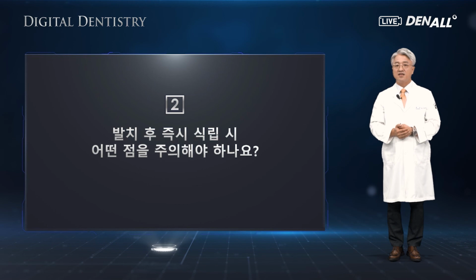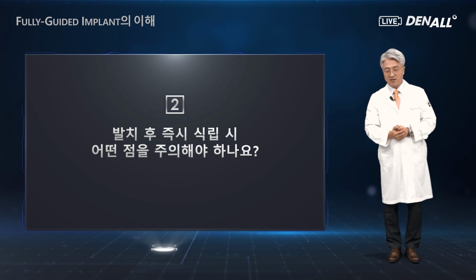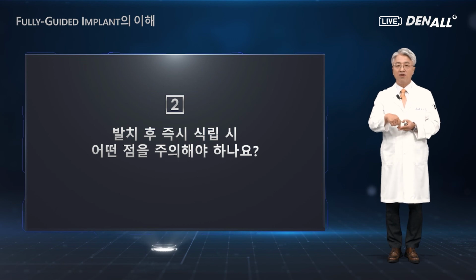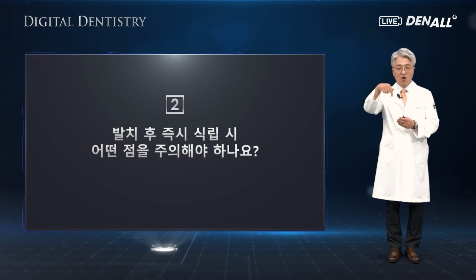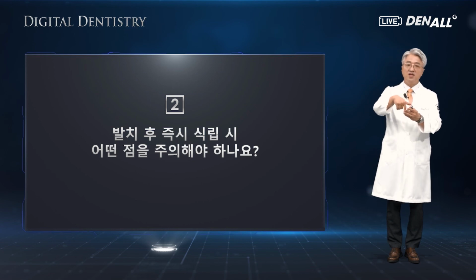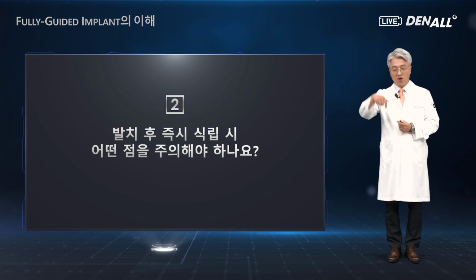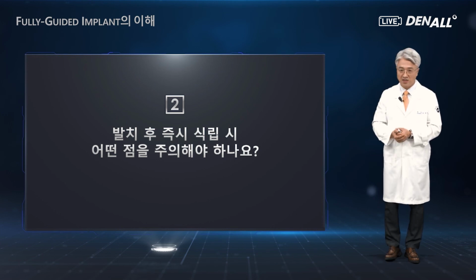Right after the extraction, during immediate placement, if I feel the drill is slipping rather much, then I switch from low speed to high speed with irrigation. So I use the high-speed drilling. One more thing, when we expand the drill hole, I try to expand the hole as wide as the fixture so that when a fixture is placed, it cannot slip, even though the initial stability may become low.